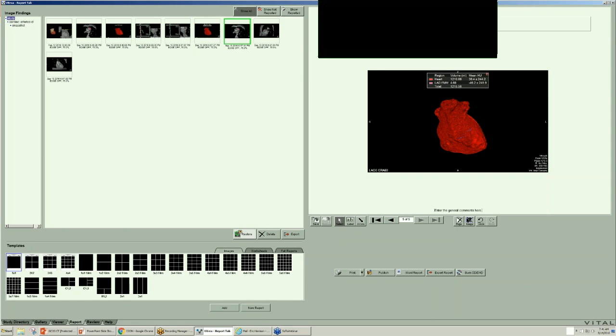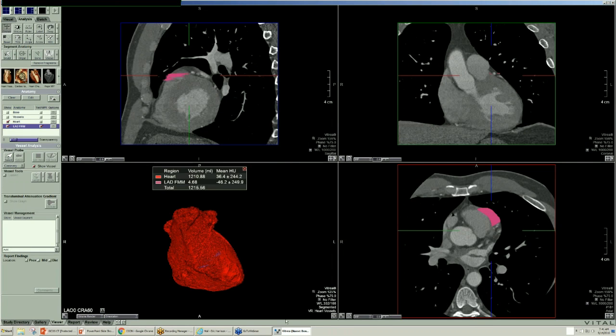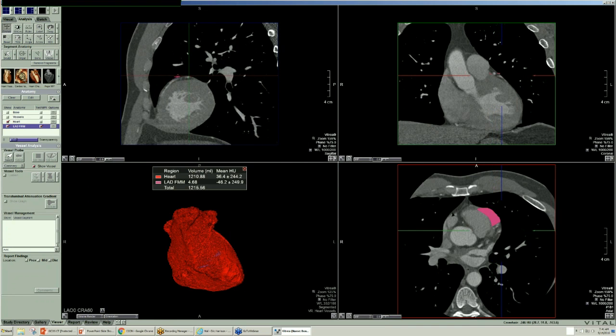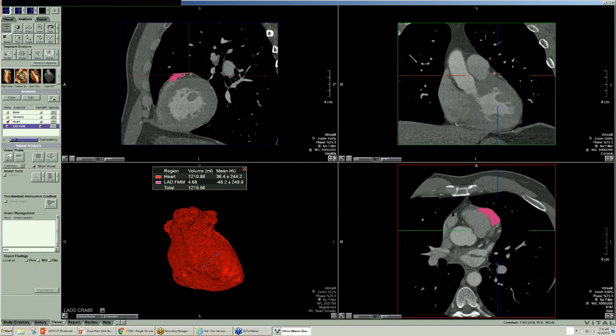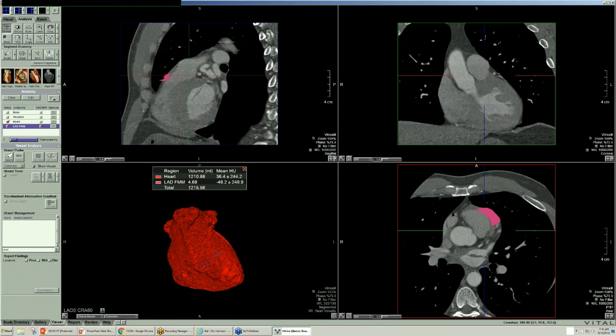At least a little bit about how that worked. I didn't get the entire LAD, but I was just experimenting with it, trying to get a little bit of the LAD. And so let's bring that up right here. Here's where we're taking some of the muscle and we're outlining it and identifying it and scrolling through it. We didn't get the whole thing, we're just doing a test here, so we just got a little bit of the blood supply of the LAD just to see if we could fractionate that and get the FMM.